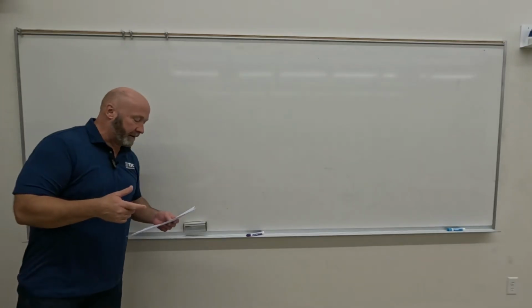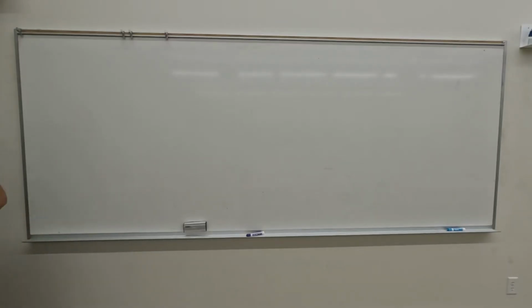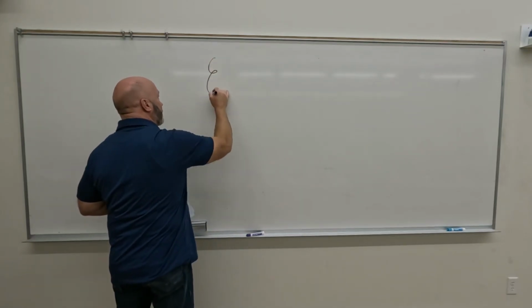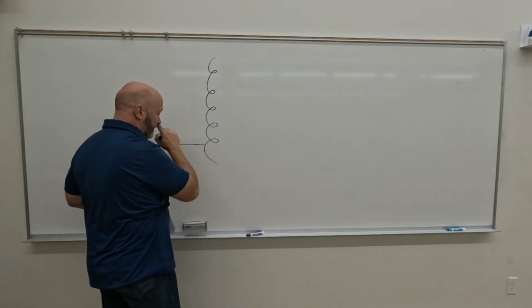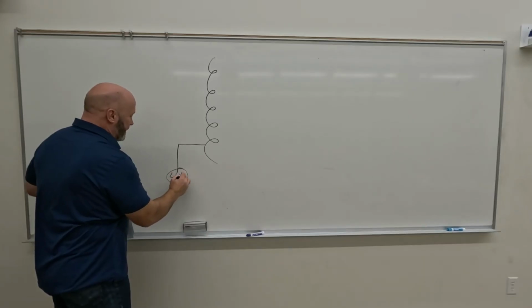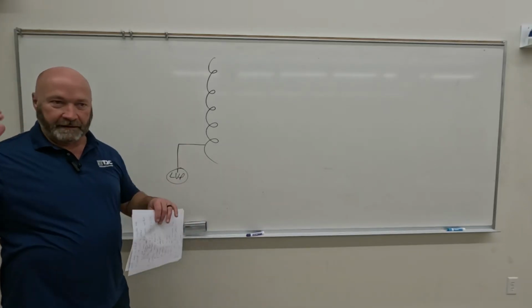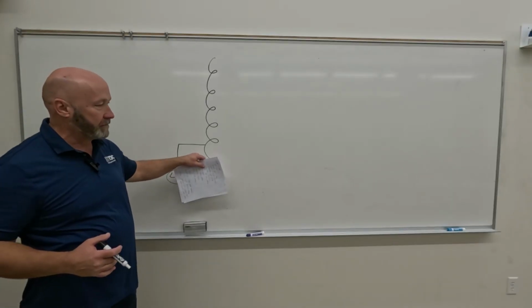We talked primarily about the control of mA. Just go ahead and start drawing it out while I'm talking about it. We talked about the line voltage compensation, which, whenever we get to the test, is the only thing that's going to come off before you get to the autotransformer. The purpose for that is to avoid the peaks and the valleys in the voltage waveform so that we get consistent feed into the autotransformer.